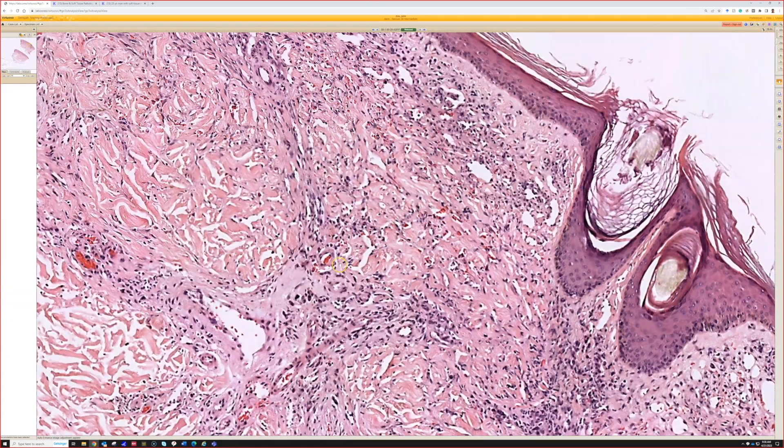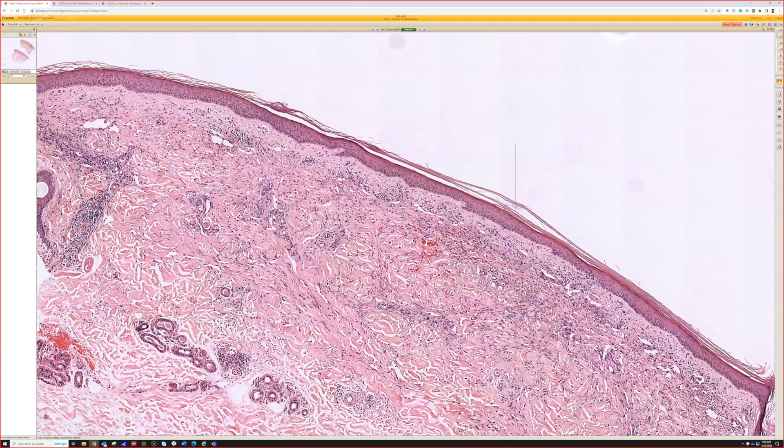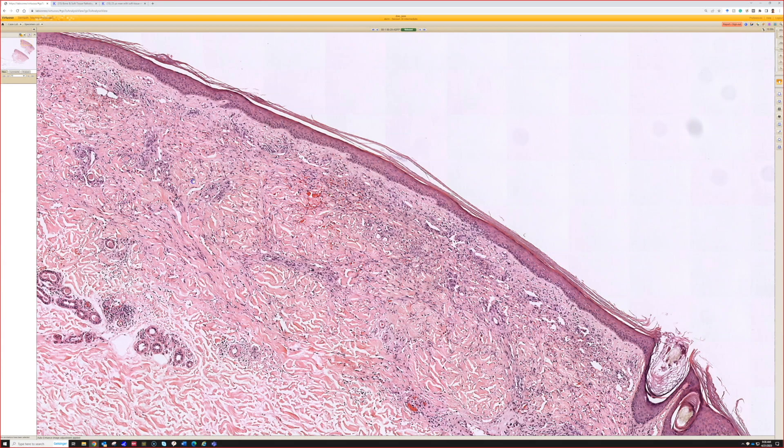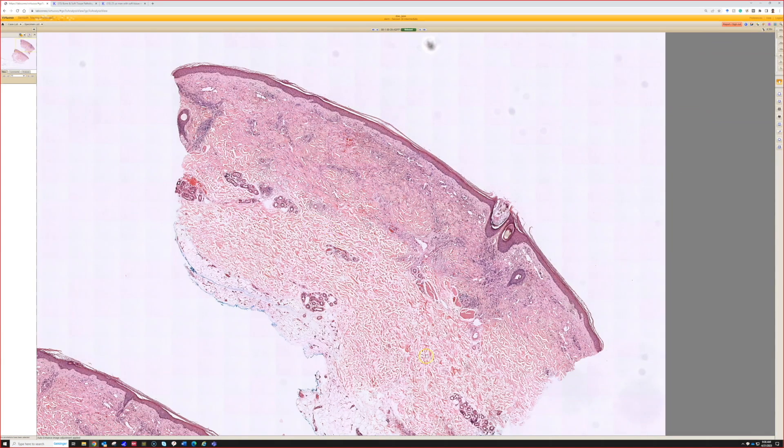This is nice Kaposi sarcoma, probably the patch stage, or maybe starting to get into the plaque stage. Clinically, I think it's labeled in the answer key as patch stage Kaposi, but there's a spectrum of changes. This one already has a significant obvious alteration. The dermis does not look normal — the normal dermis is more or less down here, and this is way more dense collagen, more cellular, more hemorrhage. There's something going on in the upper part of the dermis that's not normal, and that sometimes is the main clue we get.